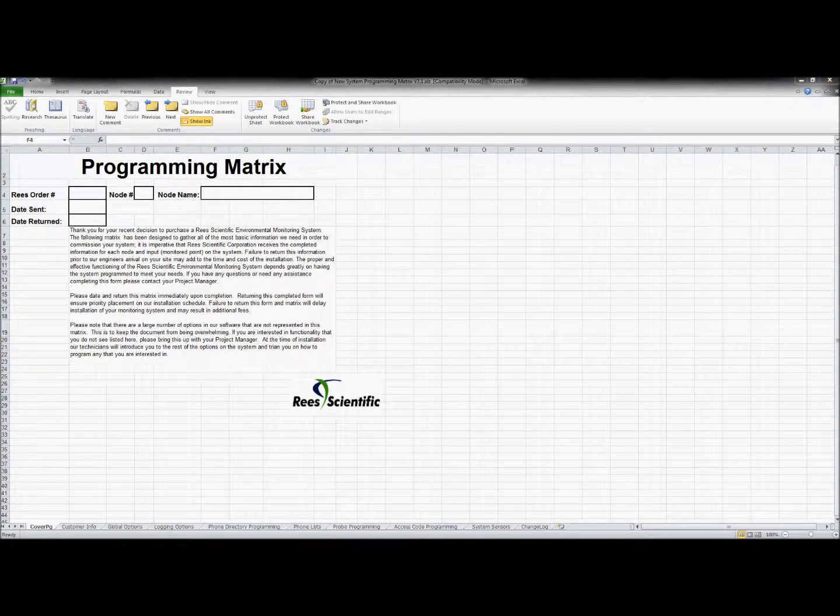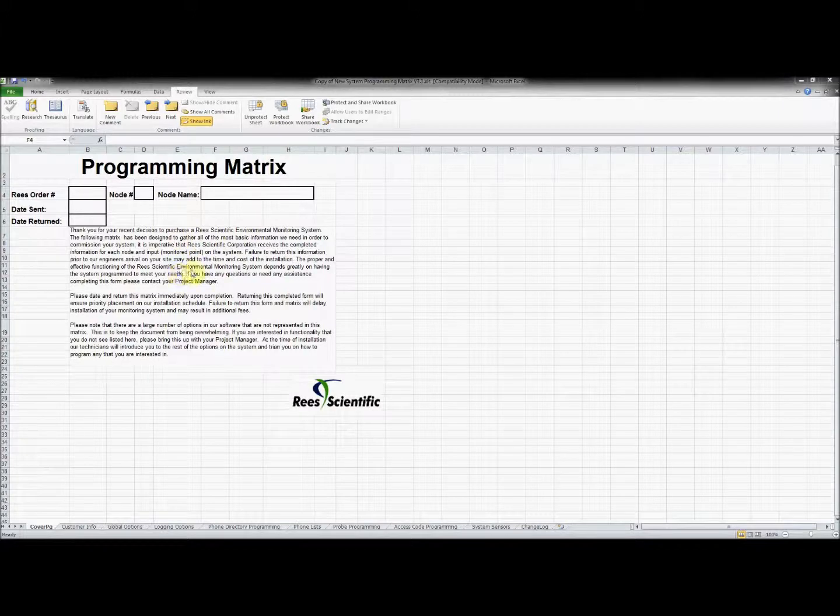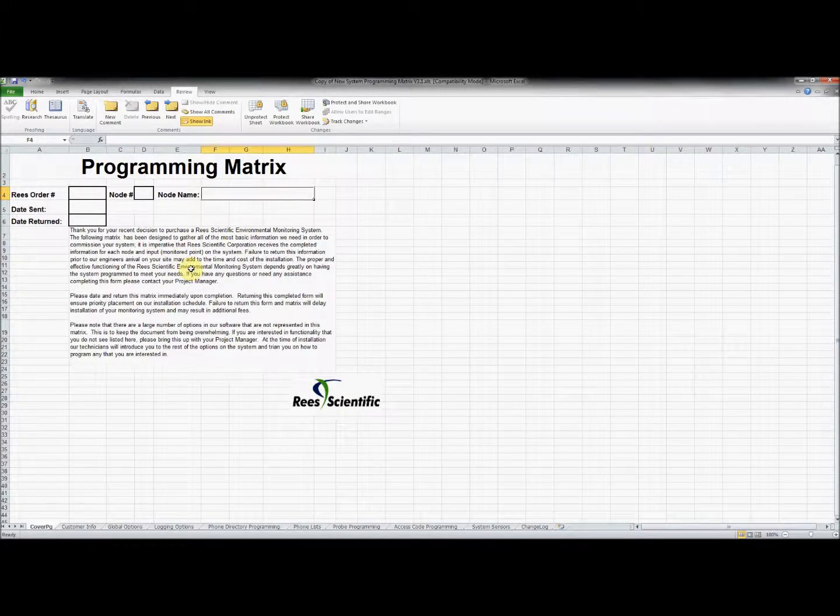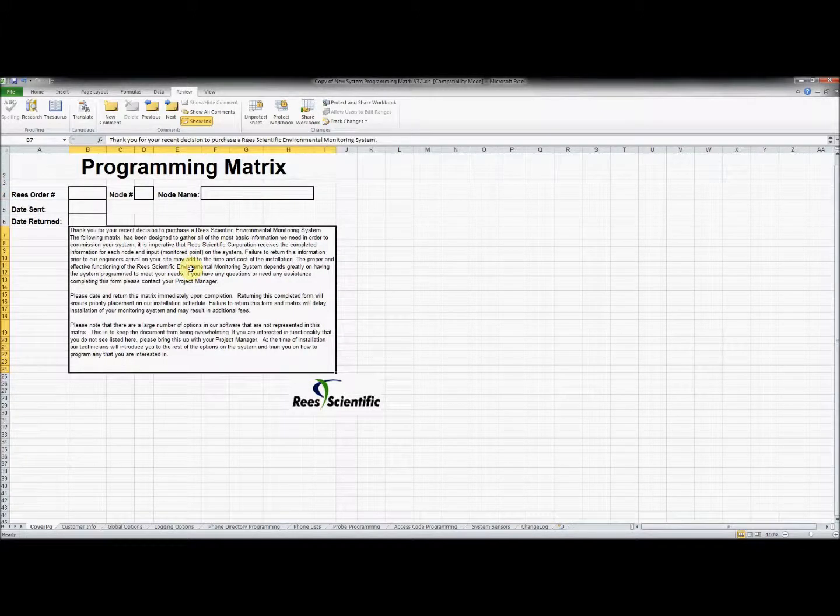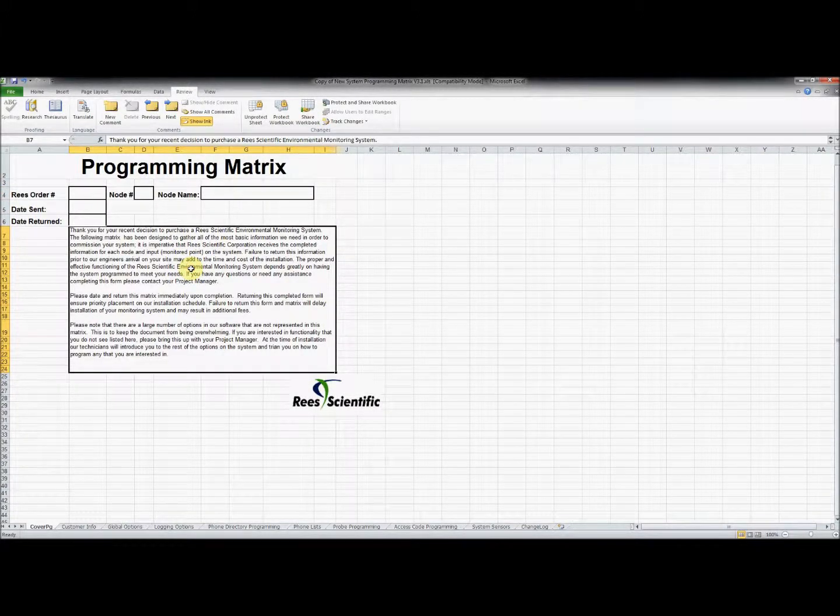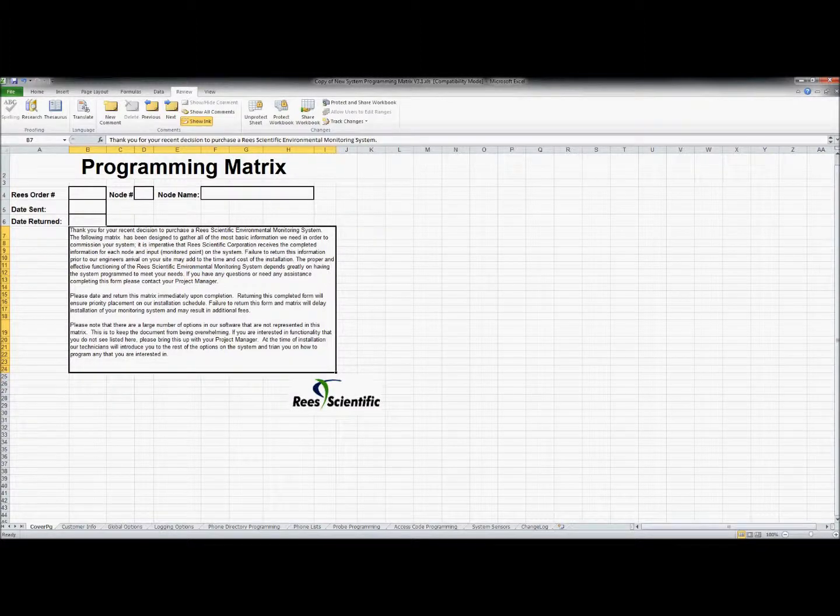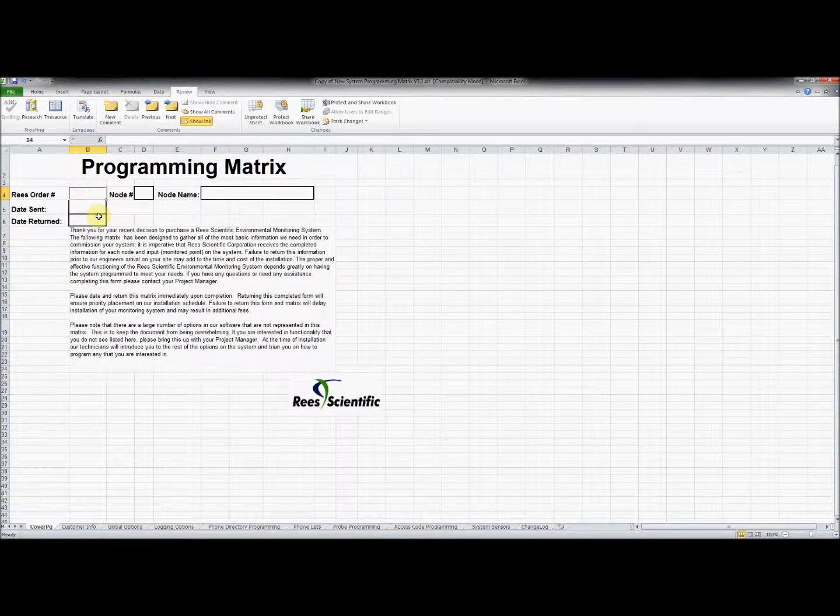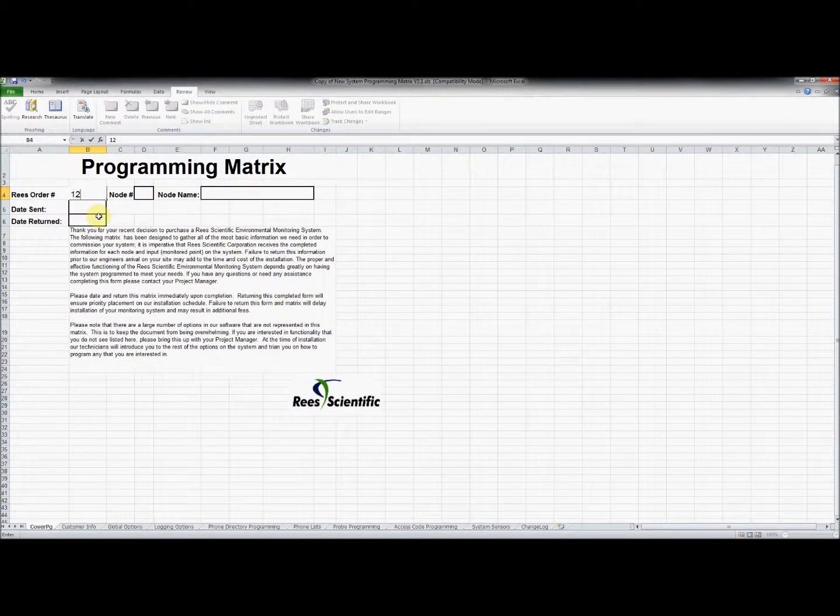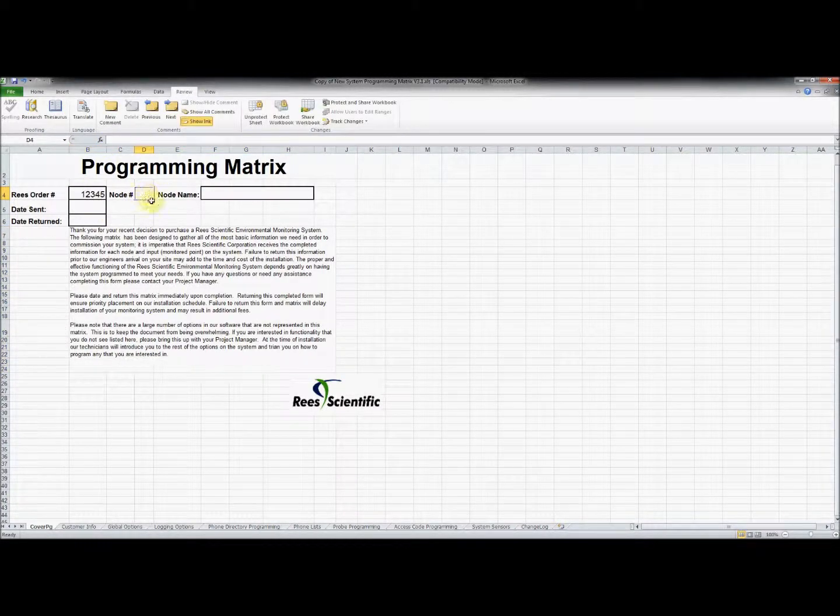On the first tab marked cover page, you will notice a message from ReScientific that emphasizes the timely completion of this document prior to the technician's arrival. Please also note that a programming matrix will need to be completed for each node you have purchased. Fill out the information on this page by clicking the empty boxes and entering your order number, node number, name, and the date.